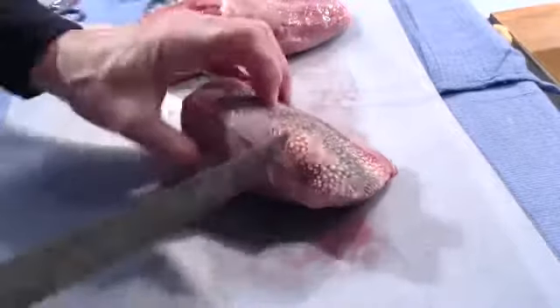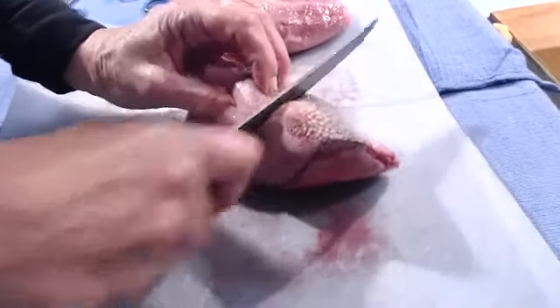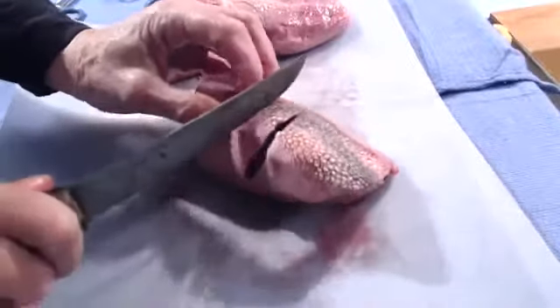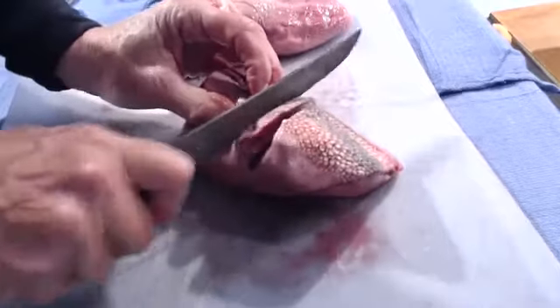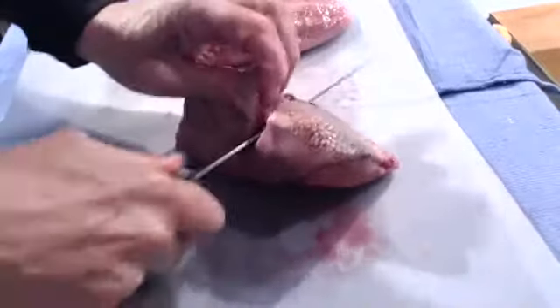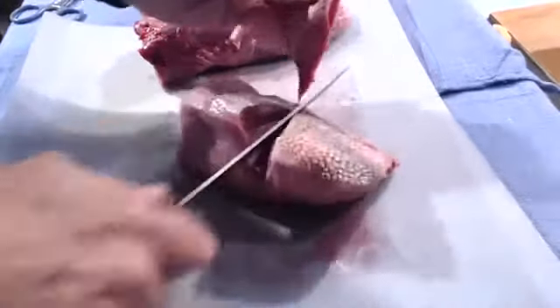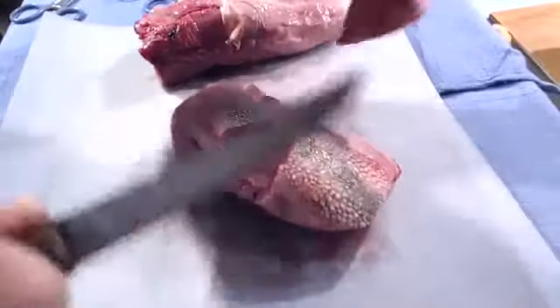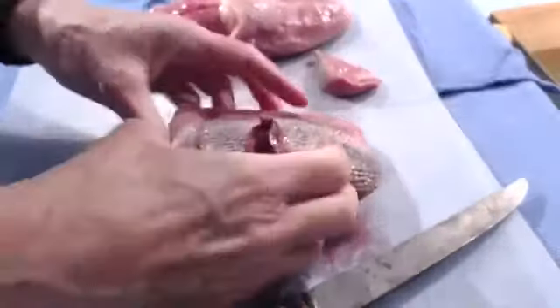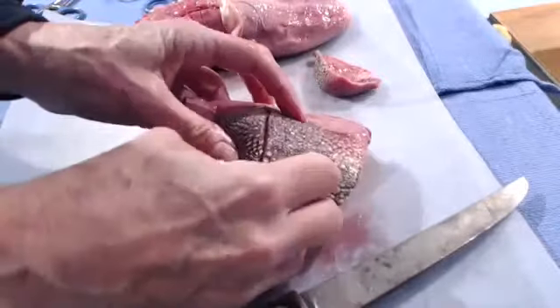So in order to make the model you can either cut a single cut such as this to make your laceration. But I'm actually going to take out a wedge of tissue for this model. This is a new technique that I'm trialing so no idea of how well it will work but the goal of the change is that we have a tear that sits open instead of sits closed and when we bring it together we have to actually do work to bring it together.